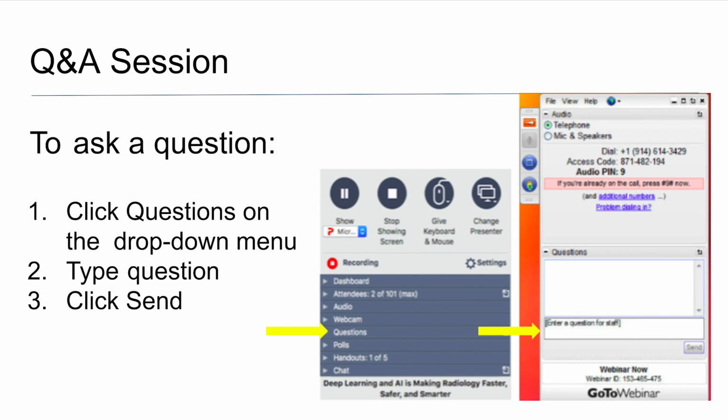So we take information from CT or MR, which is more anatomical, and put this information into PET, and by using deep learning we train an end-to-end model to leverage all the possible information. Both the original low quality PET, even though it's low quality, has a lot of the necessary information for the function, and also the information from the anatomical imaging. By combining this twofold information, we can really push the limitation of a faster scan or low-dose scan.